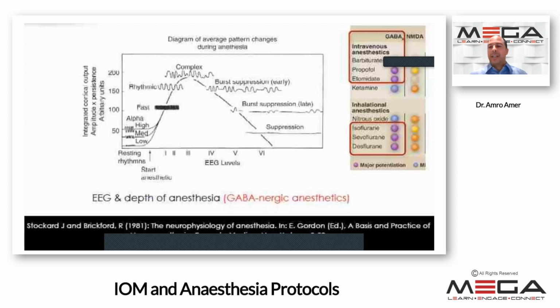Etomidate actually is GABAergic, but for us it's increasing our signal, etomidate and ketamine. So we tend to like it. If we increase the dosage, we can tell from our EEG. We usually run EEG in each case, so I can tell the anesthesiologist how deep the patient is, even if you're not using BIS or Masimo. I cannot give him a number, but I can tell him I have burst suppression, either from a regular bolus or a high maintenance dose, and how much the burst suppression is.